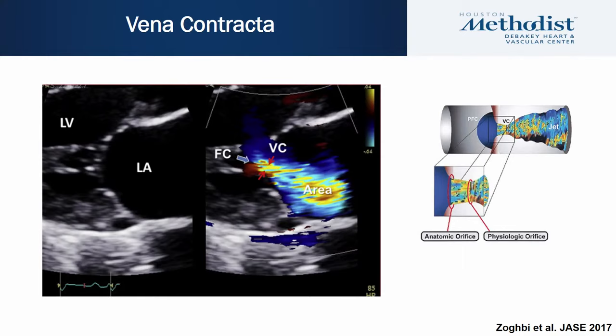Vena contracta is the diameter of the narrowest part of the jet and is another parameter used when evaluating MR severity.